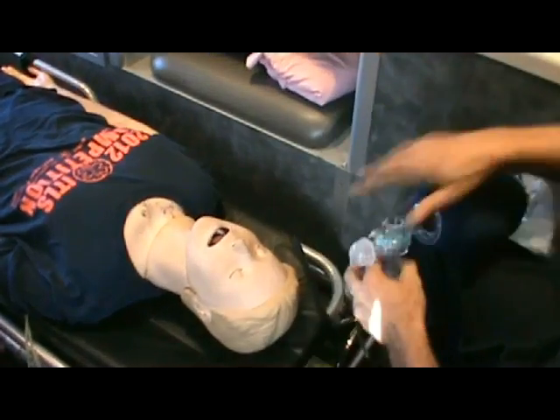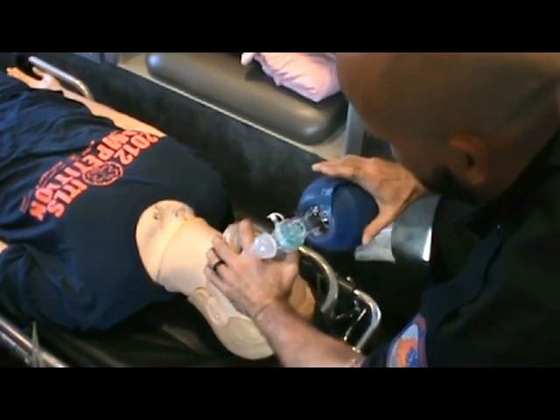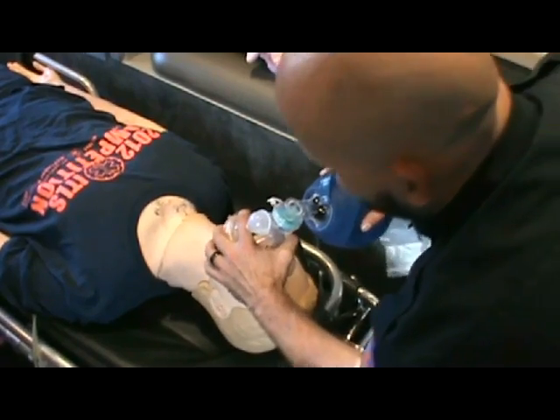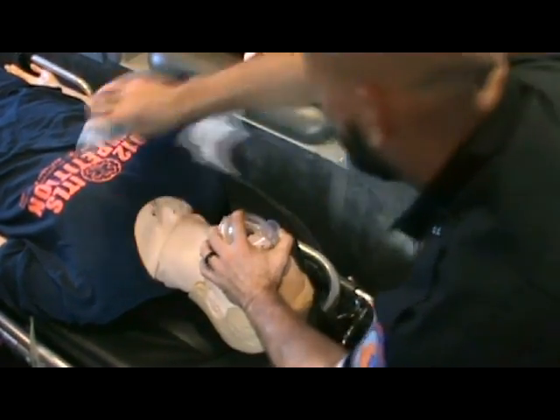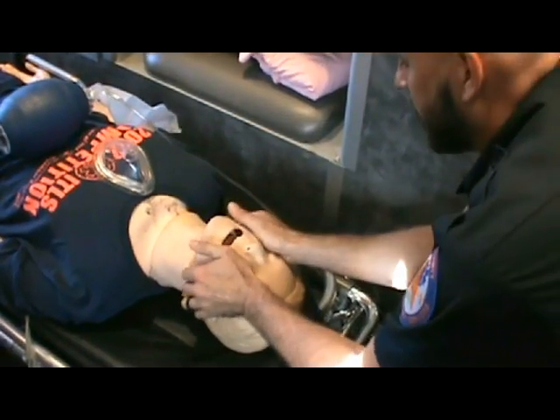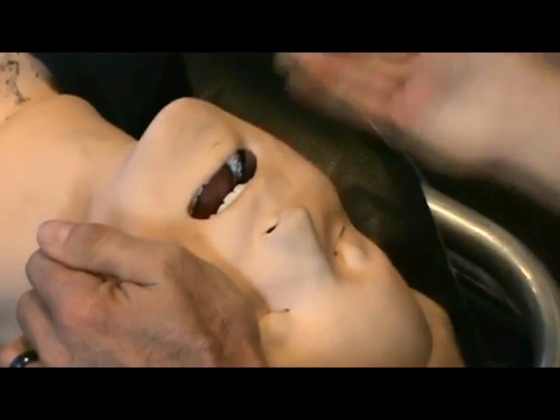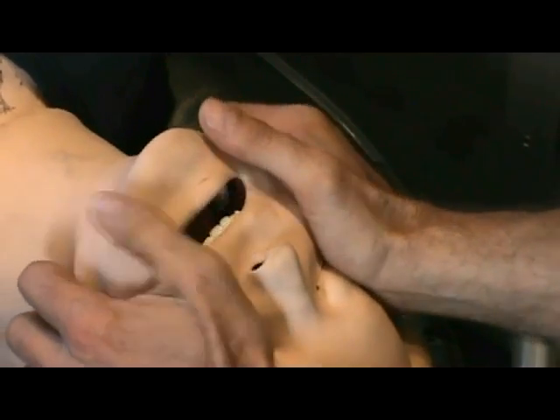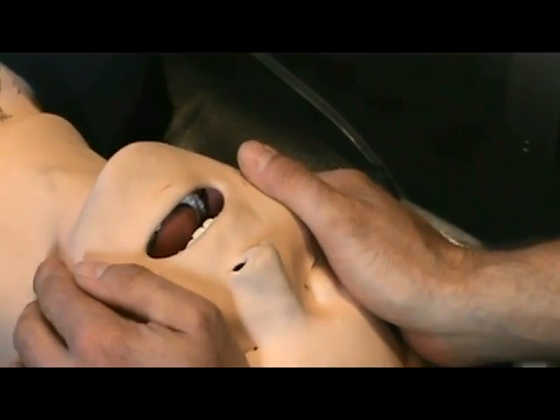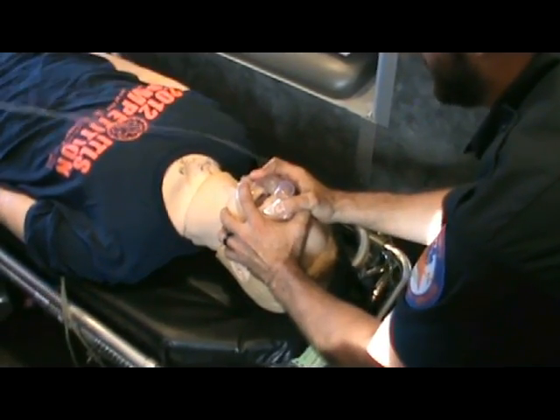We've all done this, especially on a kitchen floor — if I do a head tilt–chin lift, 99% of the time the head flattens back out and I can't hold it without putting undue pressure under the chin. With two-person BVM, I've got full control of the head. With jaw thrust, we've always been taught this technique, but it looks like you're closing the mouth. What I need is to get the jaw open so I can get more air down into the trachea, and then the second person goes ahead and starts bagging.